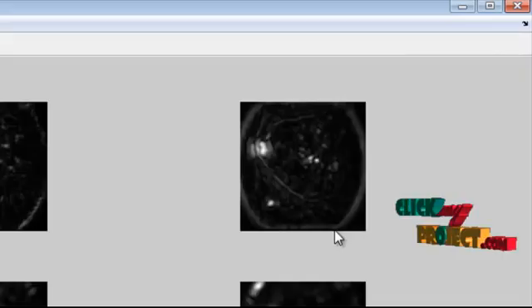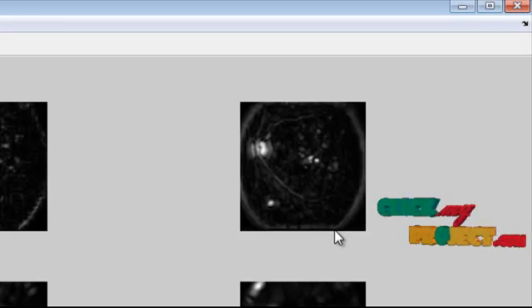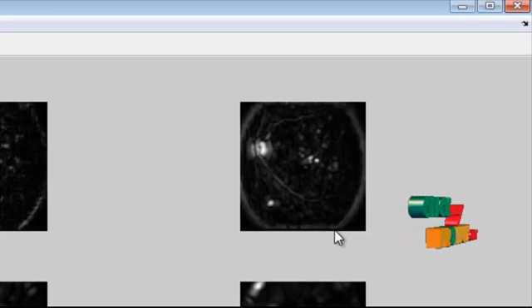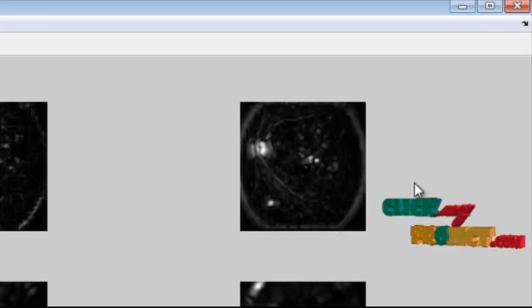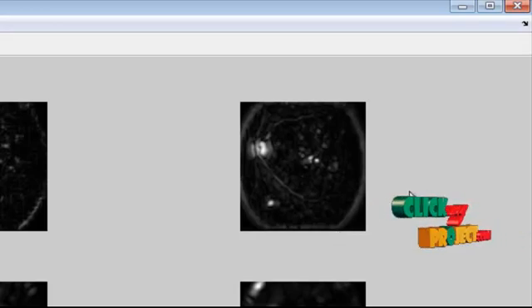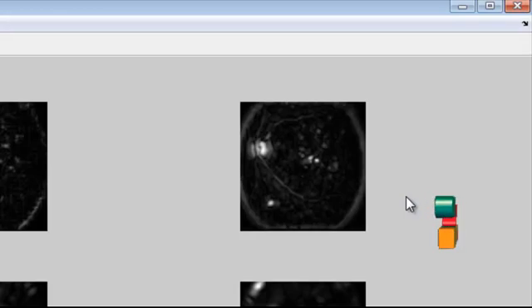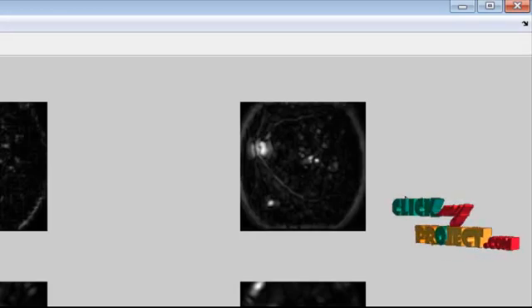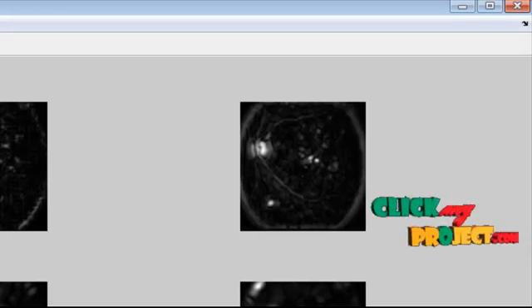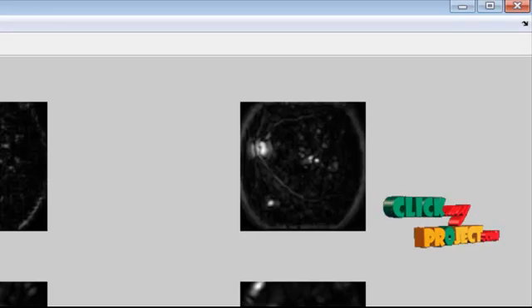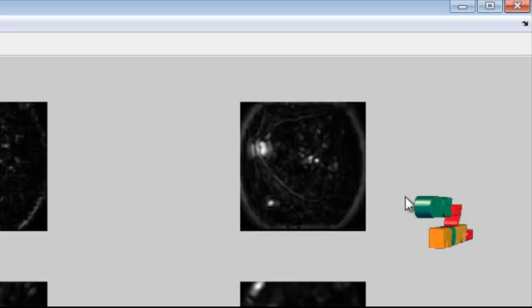Feature extraction based on GABOR wavelet transform is done. These outputs are the GABOR wavelet transform computed for theta spanning from 0 degrees up to 170 degrees at steps of 10 degrees.